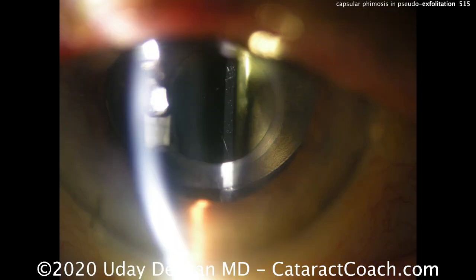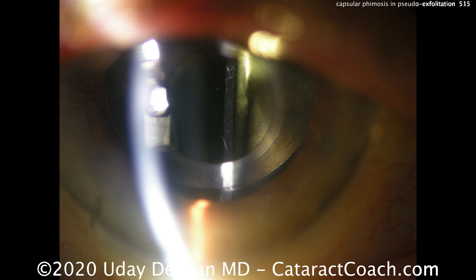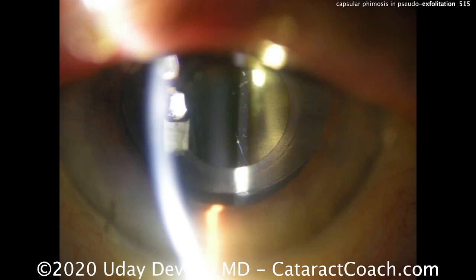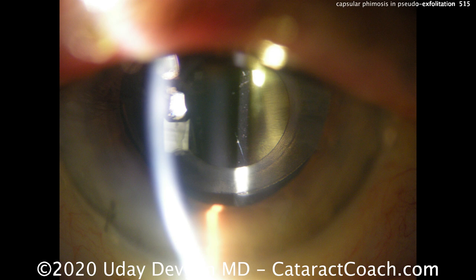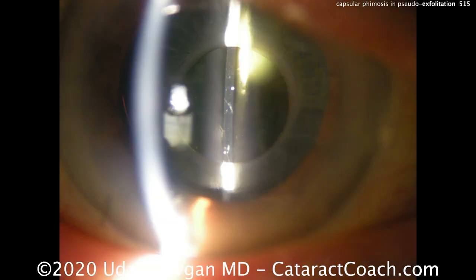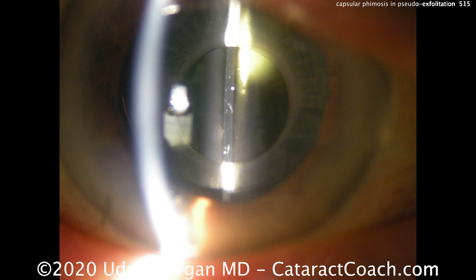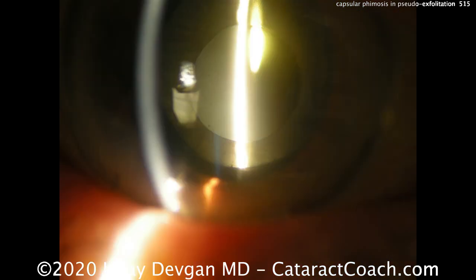This eye that already had surgery had significant capsular phimosis. When the lens capsule contracted, it also pulled the IOL closer to the retina. This patient went from plano to plus 0.5 to plus 0.75 in the refraction. That means when we do the calculations for the other eye, let's be smart: let's anticipate the same contraction of the capsule and the same posterior displacement of the IOL optic. So when you do the lens calculation for the second eye, let's not aim for plano — do your regular lens calc, but aim for at least minus 0.5, maybe even minus 0.75.